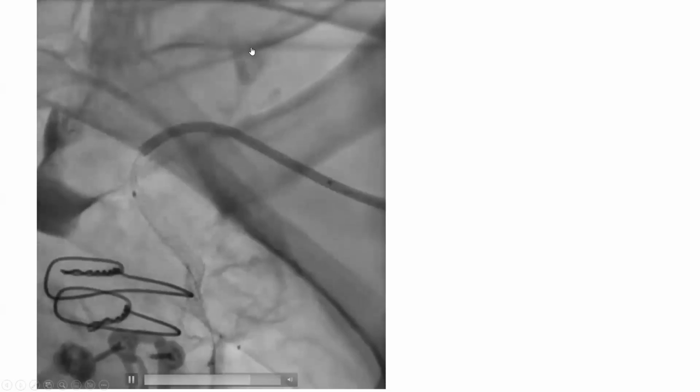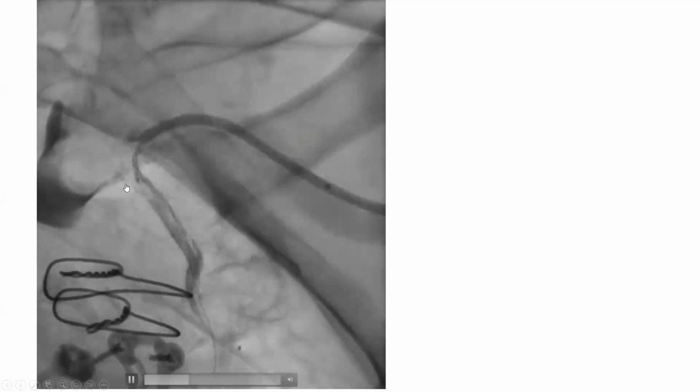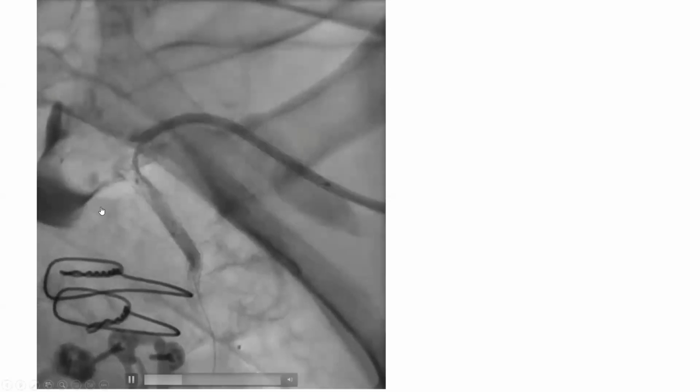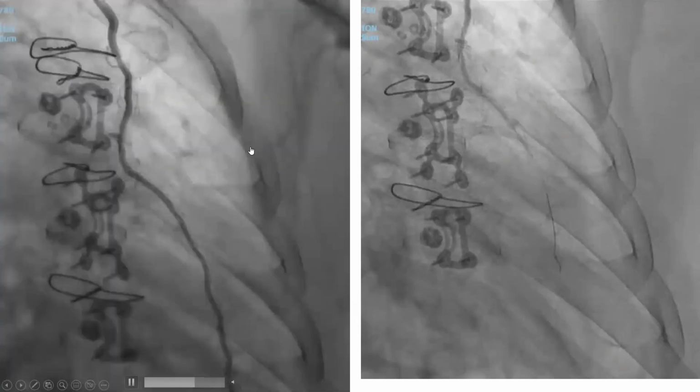And here also we assess whether there is a pressure gradient across that subclavian. We compare the pressure across the guide tip with the non-invasive cuff pressure in the right arm, and there was no difference between the two pressures. And this is the final image here.